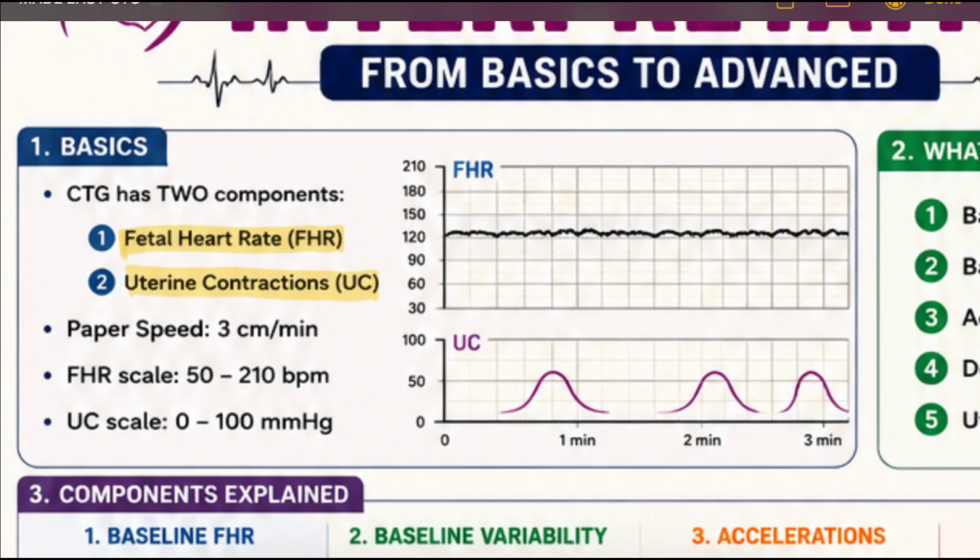So fetal heart rate, you can see here. This is the heart rate of the fetus, and here you can see the mother's contractions. Whenever you are looking at a CTG, we have to compare the heart rate along with the contractions. Think of CTG as monitoring two patients simultaneously: one is the baby's fetal heart rate, and the other is the mother's uterine contractions.